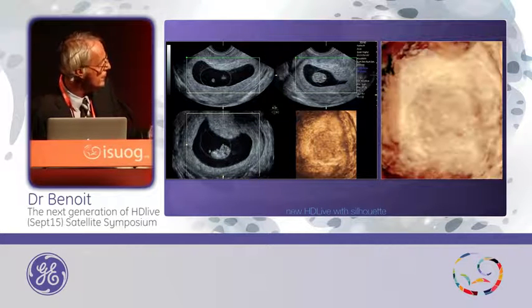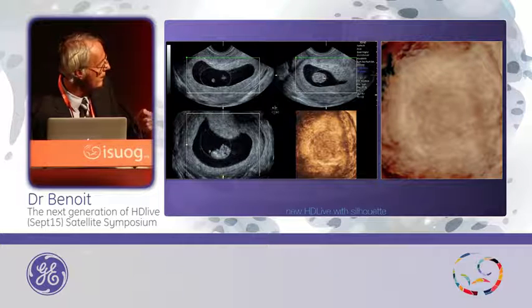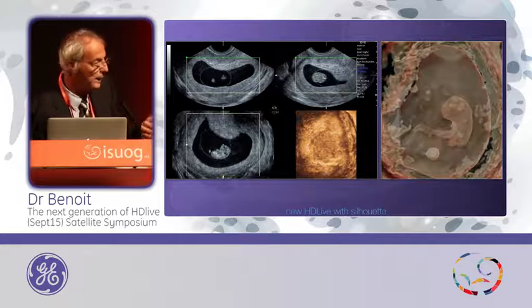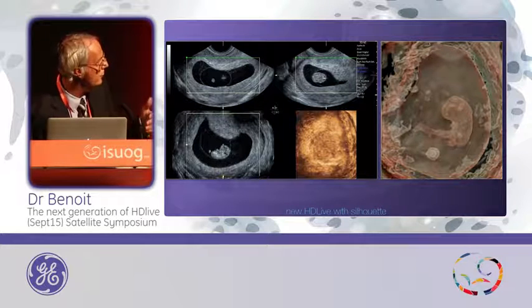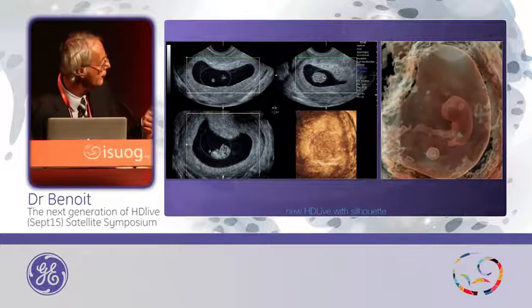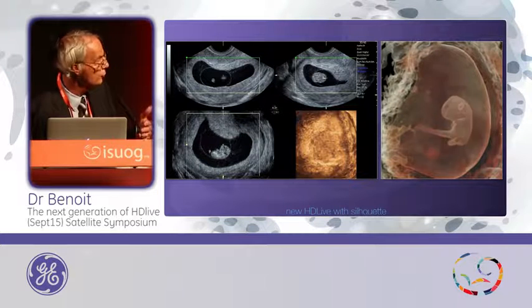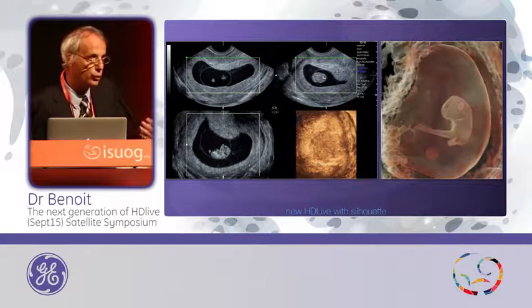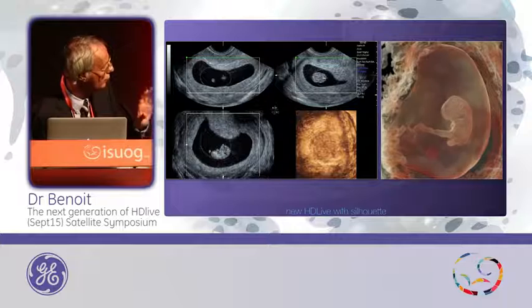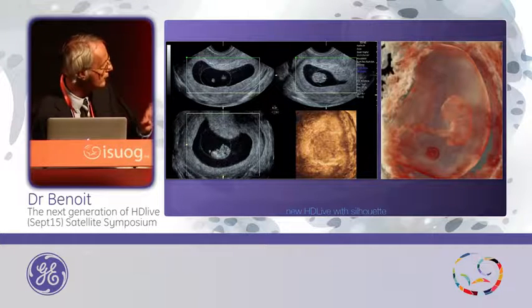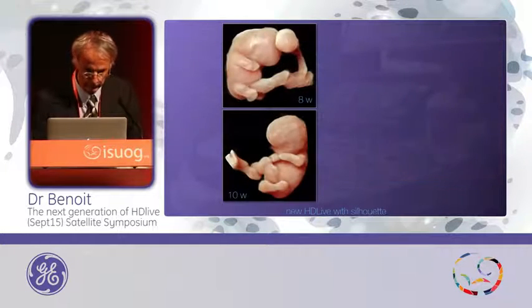Here, you choose HDLive and you will play with the silhouette. With silhouette, it's a kind of transparency and you can see what is inside. After, you have to play with the position of the light and the transparency. So you do not have to cut with a magic cut — you can look at the whole gestational sac with the transparency.